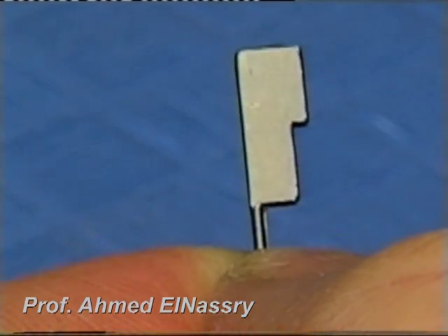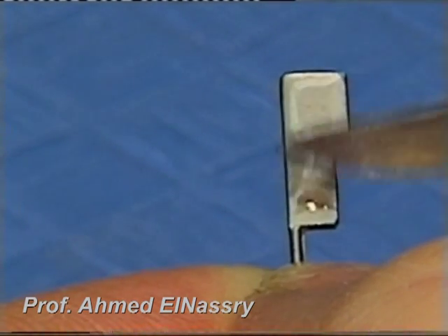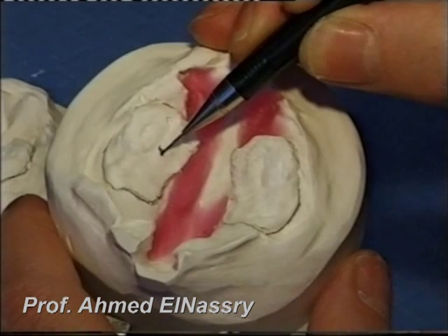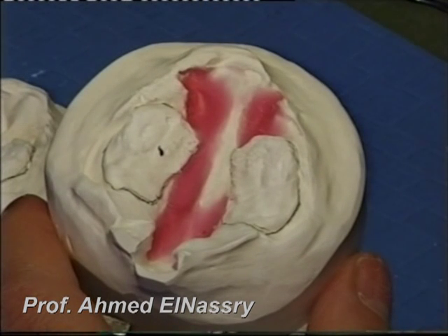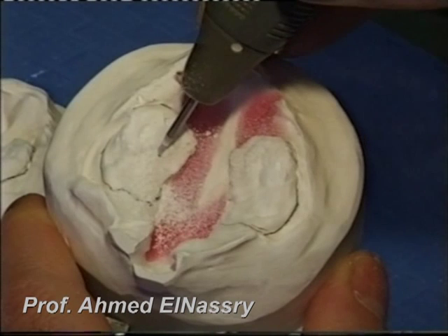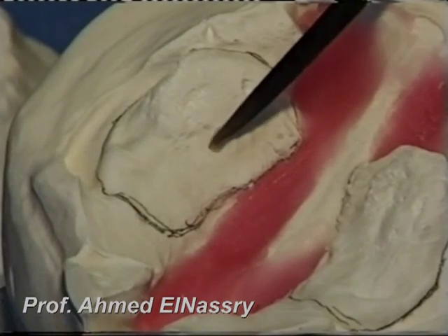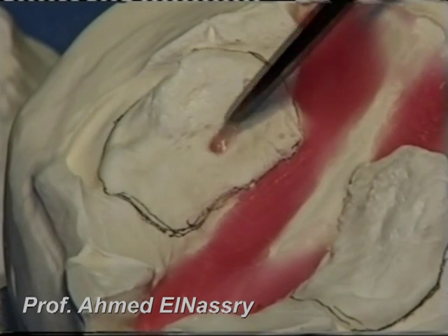Then you put a wax layer on the pin director to act as a separating medium. On the model, you mark the place of the pin insertion in the midway of the pre-maxillary portion, far from the tooth bud. After that, you start to dig a hole to represent the pathway of the pins and fill it with wax.